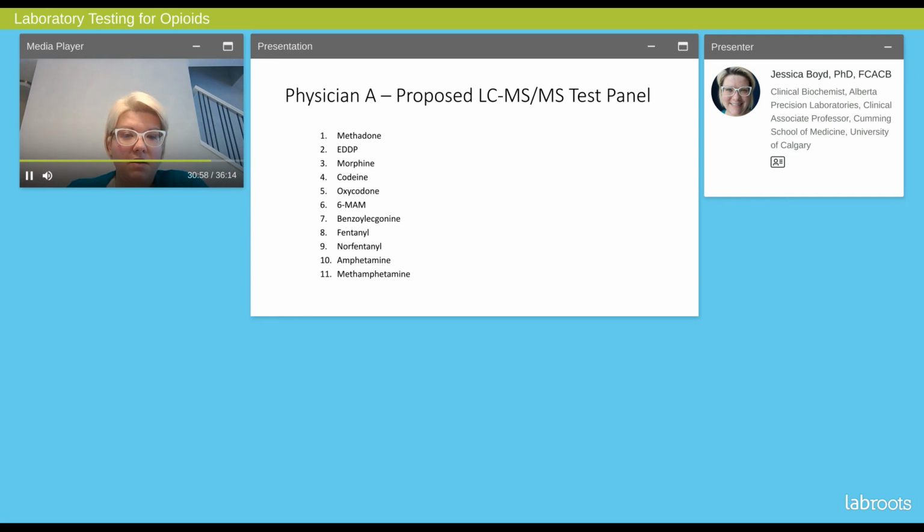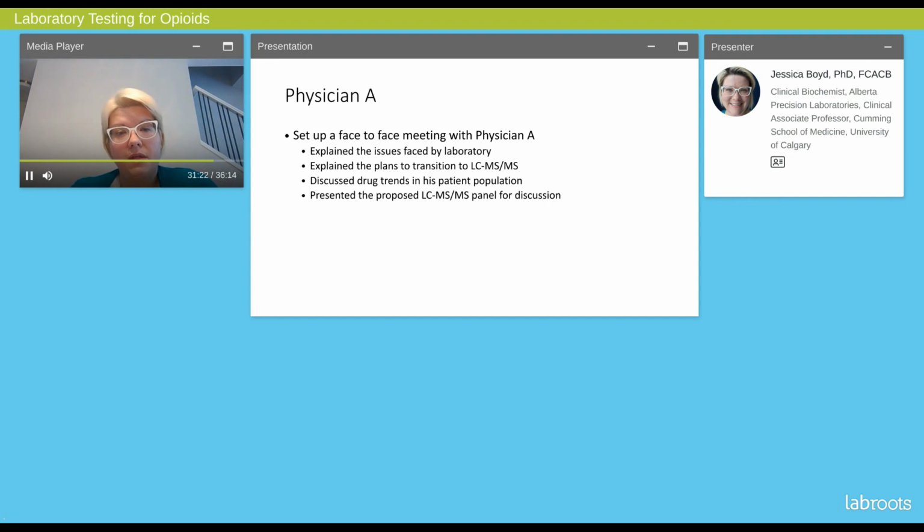At that time, his clinic wasn't prescribing buprenorphine, but we did add buprenorphine later. We have morphine, codeine, 6-MAM, oxycodone and metabolite, cocaine, fentanyl, norfentanyl, amphetamine, methamphetamine. And so we went and met with him and said, what do you think? These are the issues that we're having. That moving to this panel would allow us to give you your results in a less than 1 week time frame, as opposed to the 7 or 8 week time frame that we were dealing with at the time.